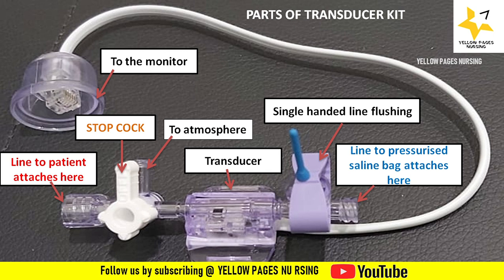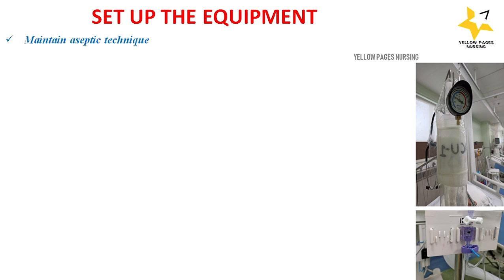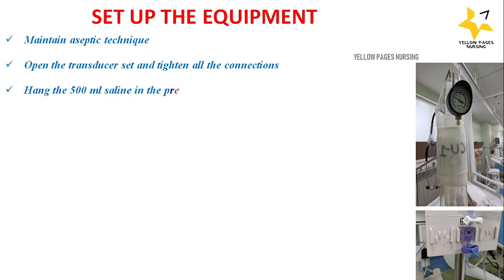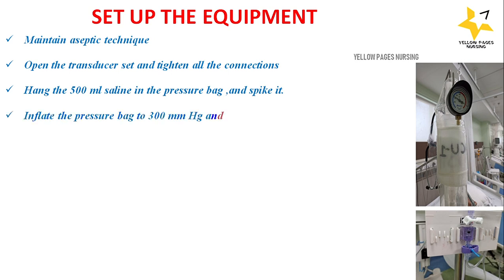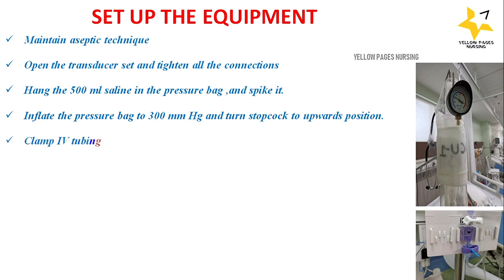Before insertion of an arterial line, the transducer setup should be done. Perform hand hygiene and maintain aseptic technique. Open the transducer set and tighten all connections. Hang the 500 ml saline in the pressure bag and spike it; add heparin according to hospital policies to keep the line free from clots. Inflate the pressure bag to 300 mmHg and turn the stopcock to the upward position to prevent backflow from the cannula.